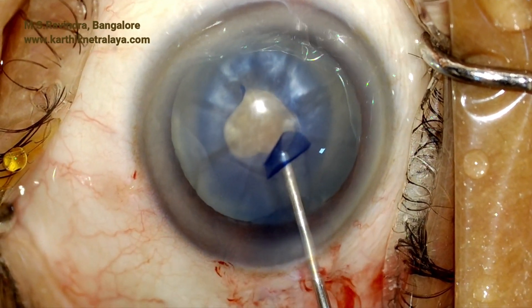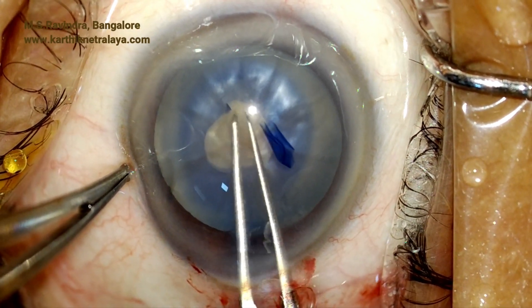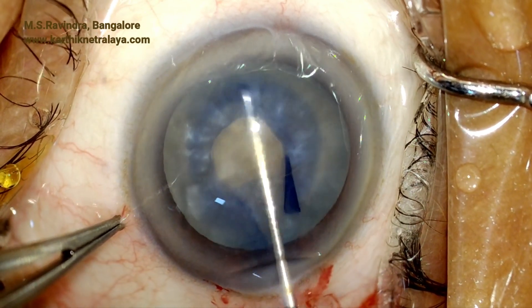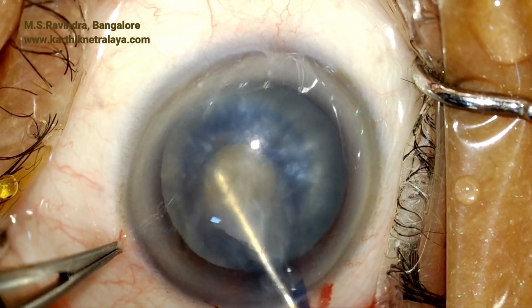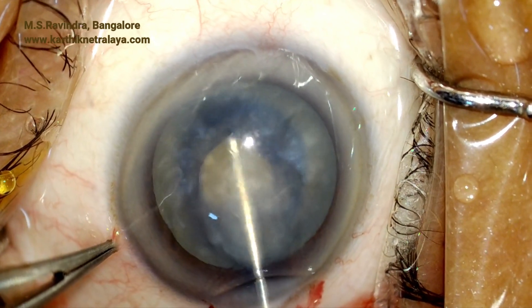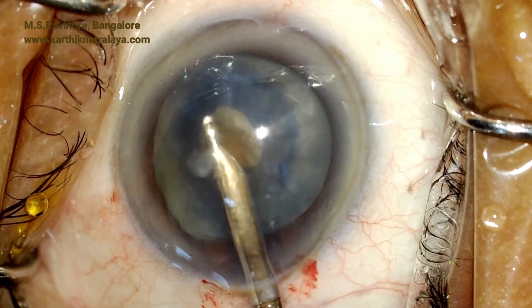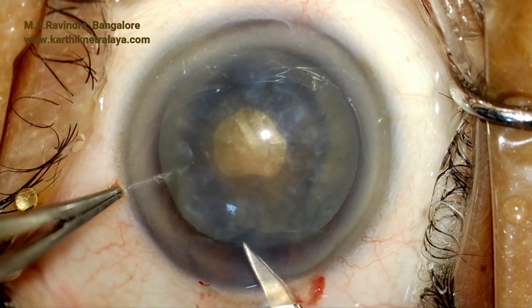The anterior end of the tunnel is further enlarged using the 2.8 millimeter keratome, ensuring that the anterior end of the tunnel remains straight. There is a small flap which could go to the periphery, so it is removed with Utrata. The nucleus is rotated; the chamber is kept slightly shallower than normal to facilitate nuclear rotation, and the peripheral cortex is disturbed so that it flows into the anterior chamber to debulk the cataract nucleus before further management.